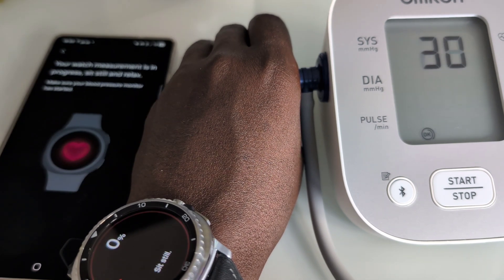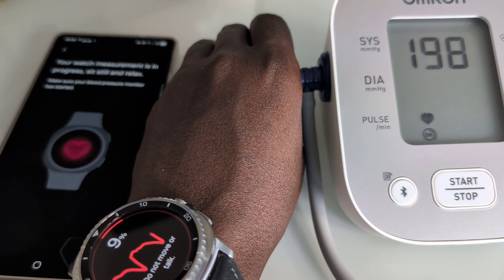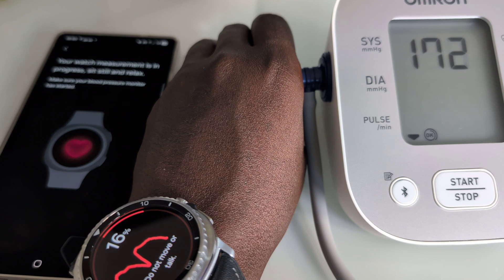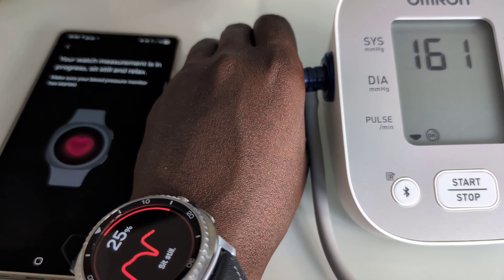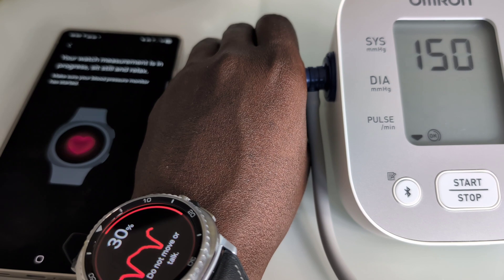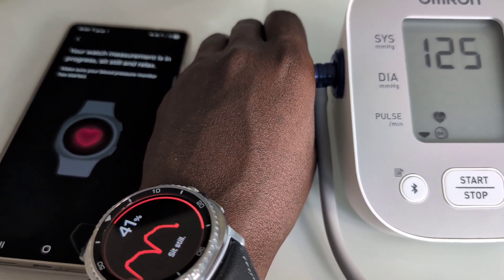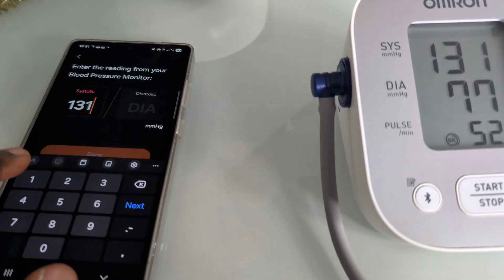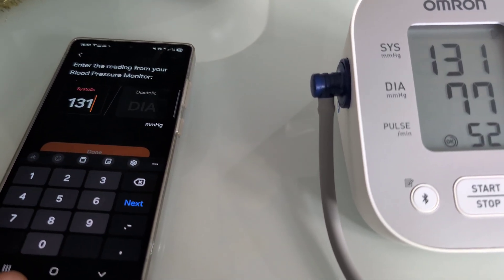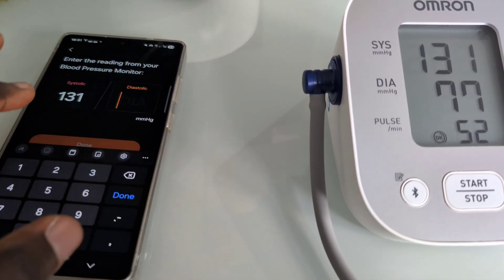You've got the blood pressure monitor and the phone with the Samsung Health app, which enables you to use the watch to measure blood pressure. We need to take three readings with the watch and the monitor and enter the number from the monitor onto the Samsung Health app on the phone.